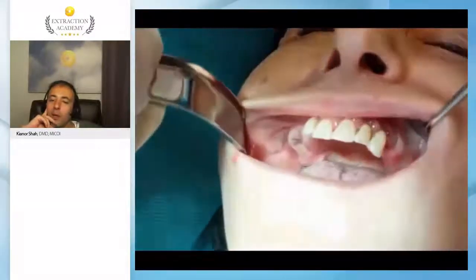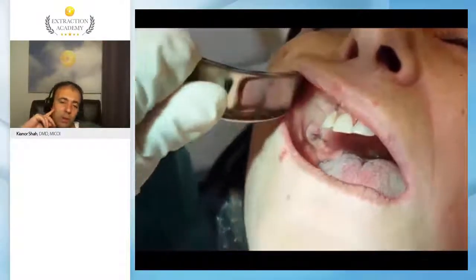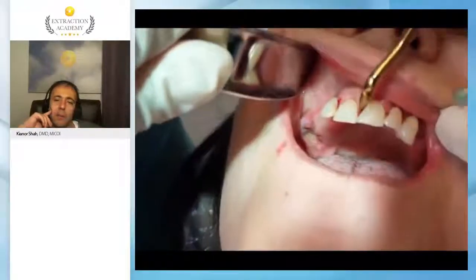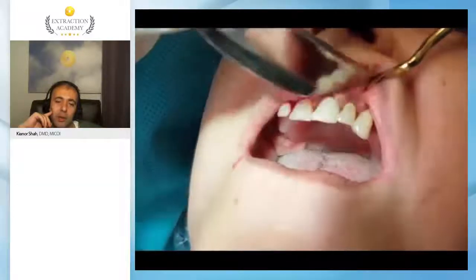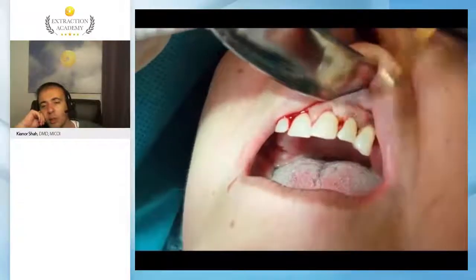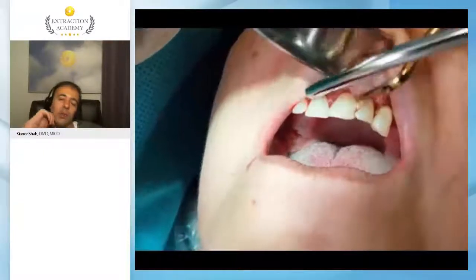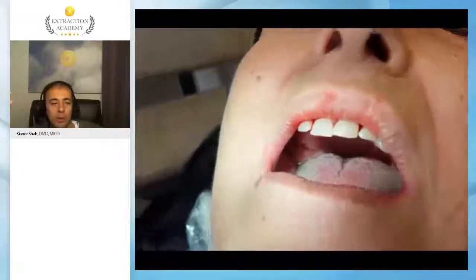So she comes back after a couple of months, and you have some good healing. Actually, no, this one she might have. This is a shorter period because I still see that we are having some sutures in there, but she has healed up pretty good in the back where we can proceed. The anteriors are always good, and if you have immediates, you can always use the adjacent two to leverage. But you have to take small things into consideration.